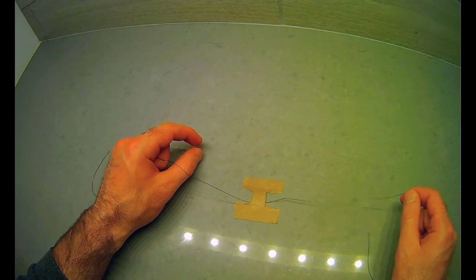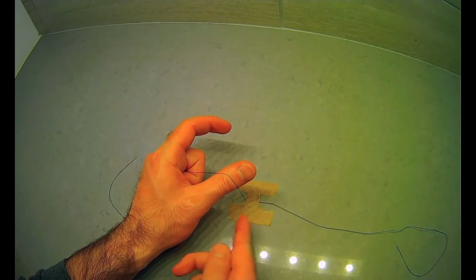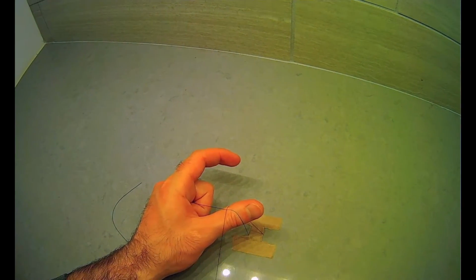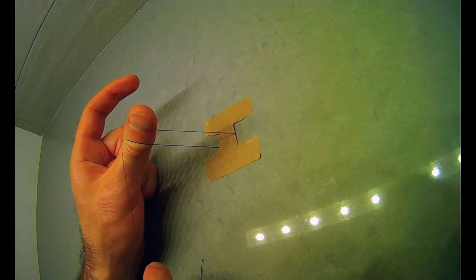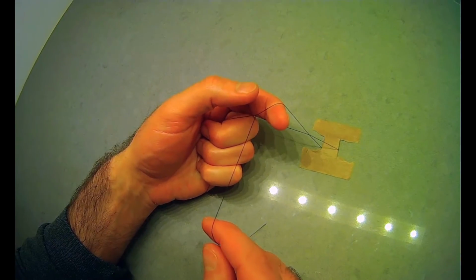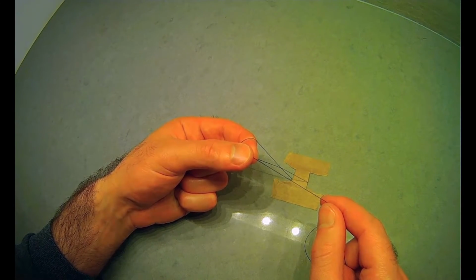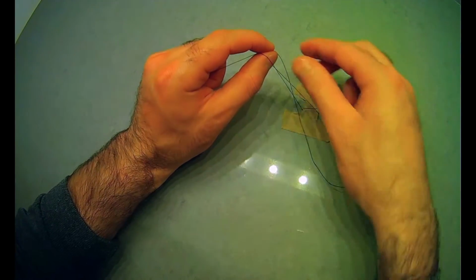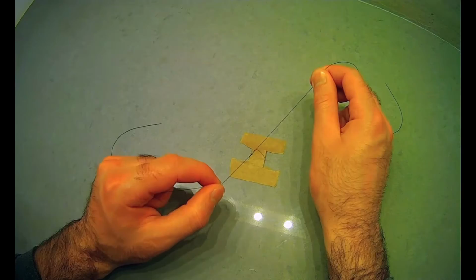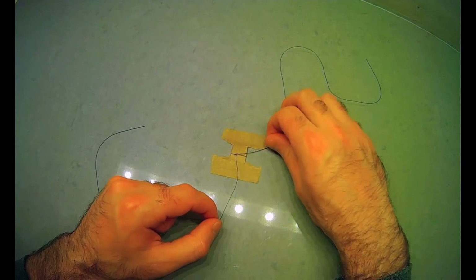And we'll do that just one more time. Here we have our initial setup, our thumb right here, and the suture's coming over it in this orientation. Make sure to keep that in mind. And then we bring the other suture around like so, creating this loop here, and then we pinch, bring our index finger through here, and then all we do is we place the suture on this side in between our index finger and thumb, and then we pull it through the other side. And then as we actually pull the knot, you can twist your orientation so it goes as flat as possible.